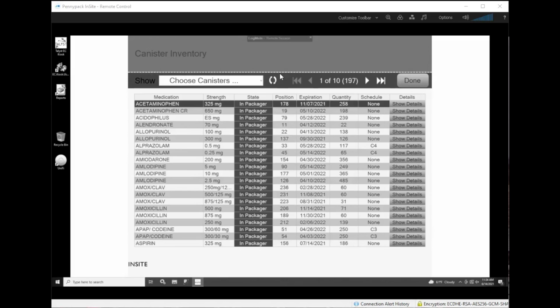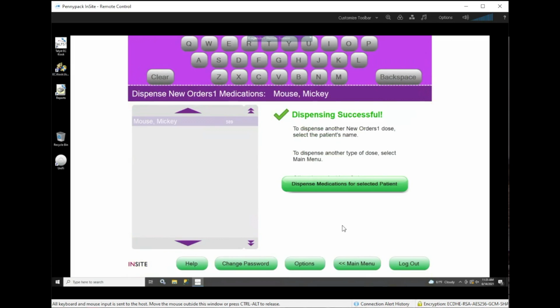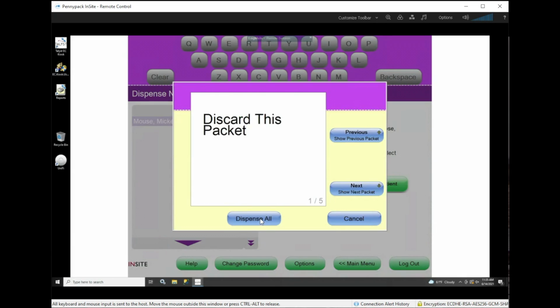So after you fixed your canister, you're going to go back to Show Canisters under Options, and now we'll make sure we refresh the screen to make sure that the machine reads the canister is back in place in the machine and that it is not jammed anymore. So now we can dispense as regular and it should work fine.